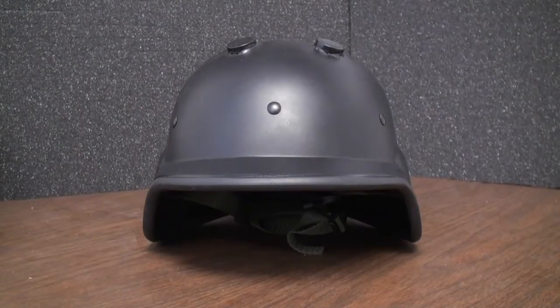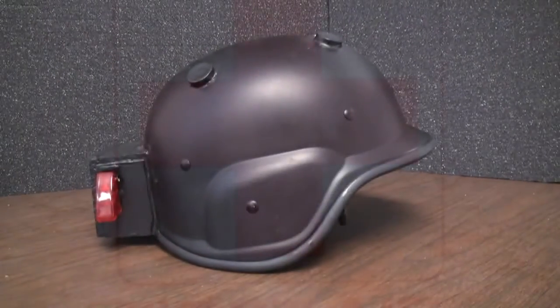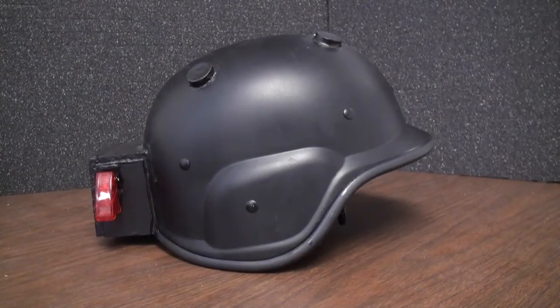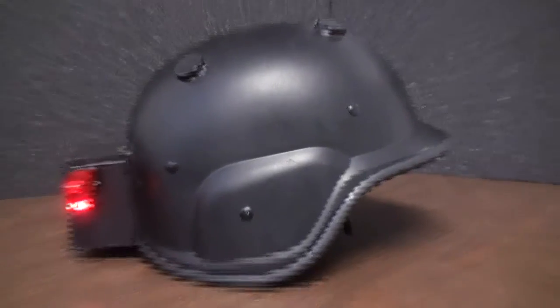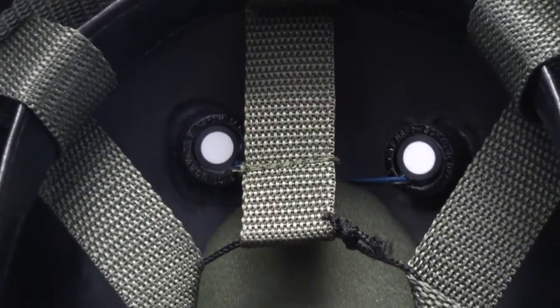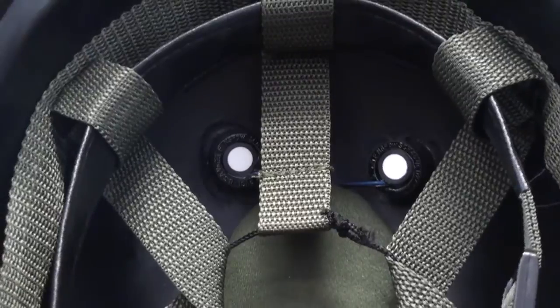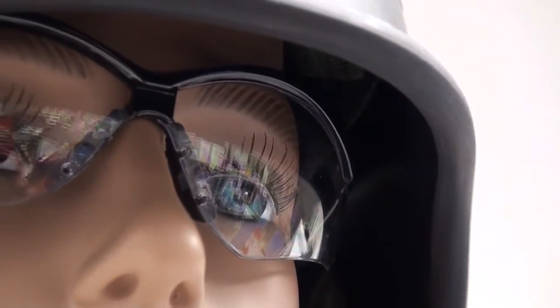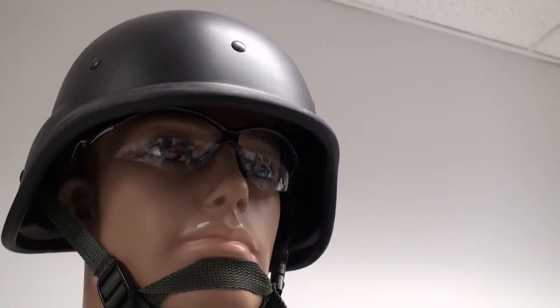You could use this for many things, including protection after traumatic brain injury. So if someone has a traumatic brain injury, it may be that you flip the switch. The switch could be automatic, and that would provide some neuroprotection following the traumatic brain injury, the initial event. Post-traumatic stress disorder, this could modulate stress. It could modulate the formation of memories. It could be used in closed-loop systems for long-term wakefulness, so you could wake people up.